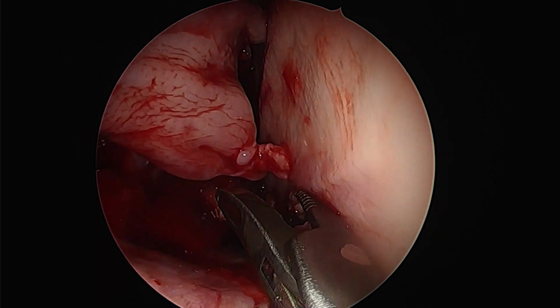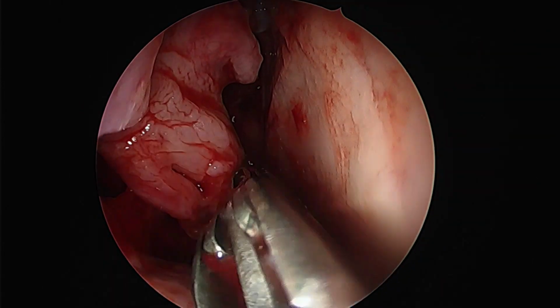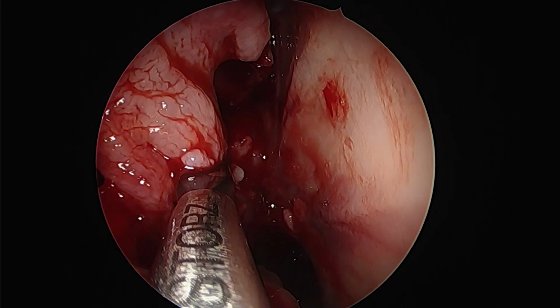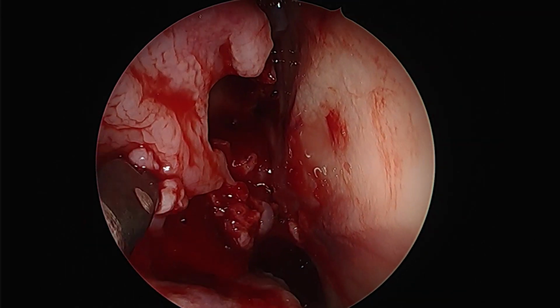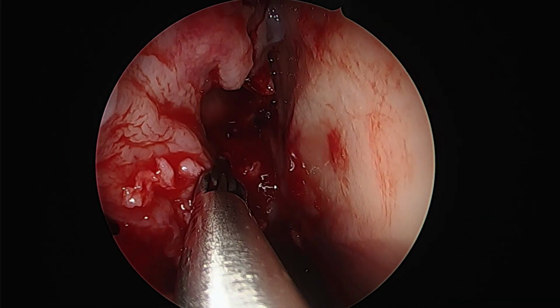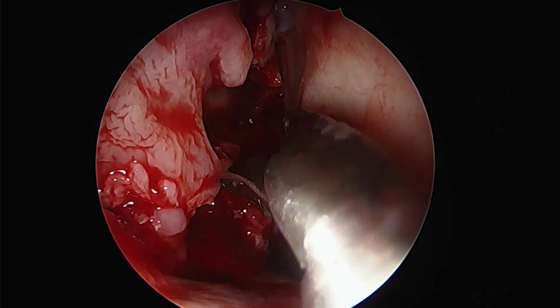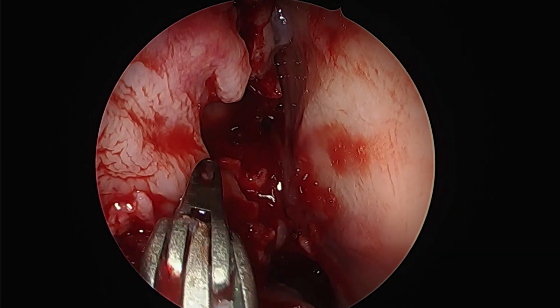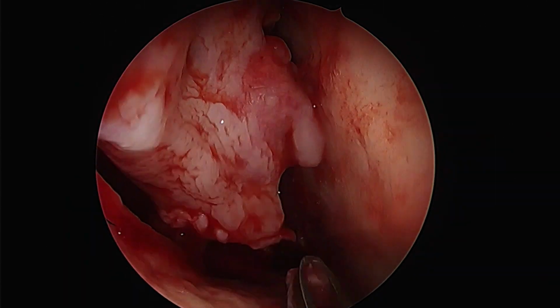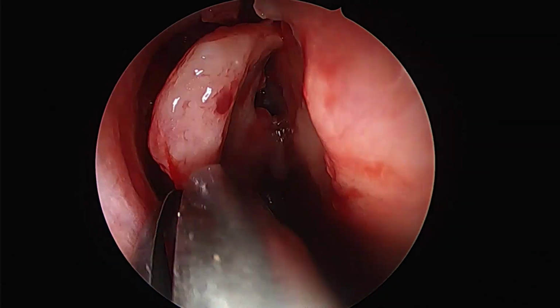So it's always preferable to cut the middle turbinate in its entirety and not shred it, because the mucosa over the middle turbinate is very valuable. One can use it to cover the skull base defect, whether in isolation or in conjunction with fat or fascia. So all attempts must be made to create clean cuts of the turbinate and to maintain the mucosal integrity as far as possible and avoid shredding of this vital tissue.